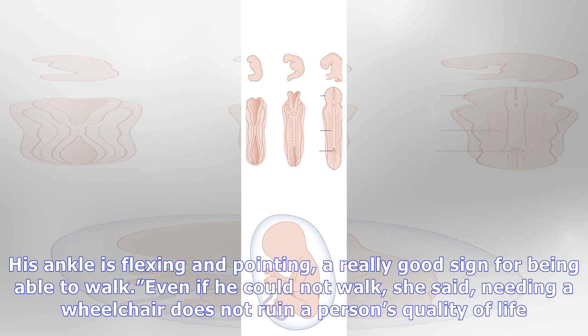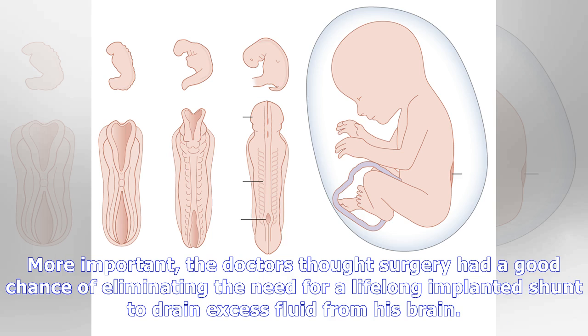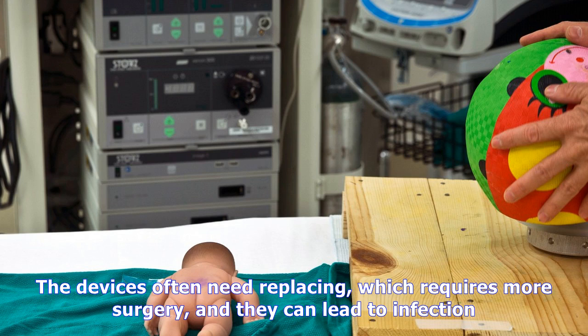To develop their fetoscopic procedure, surgeons practiced on sheep and on a simulator that they had created. It consisted of a rubber kickball with a doll inside wrapped in chicken skin that mimicked a fetus with a spinal opening. Beatrice de Giacomo for The New York Times.